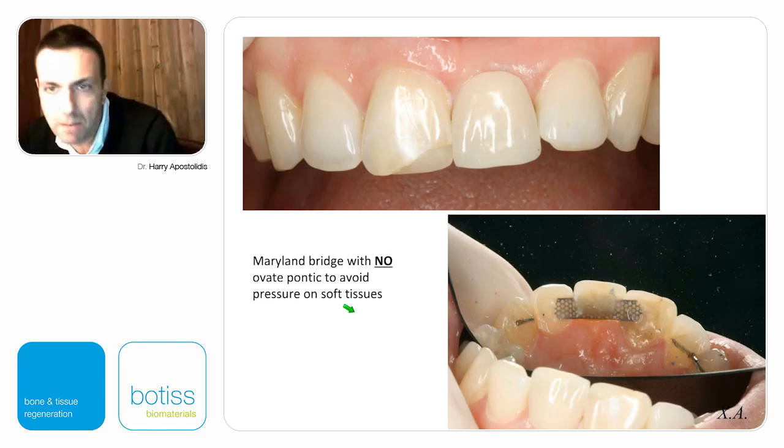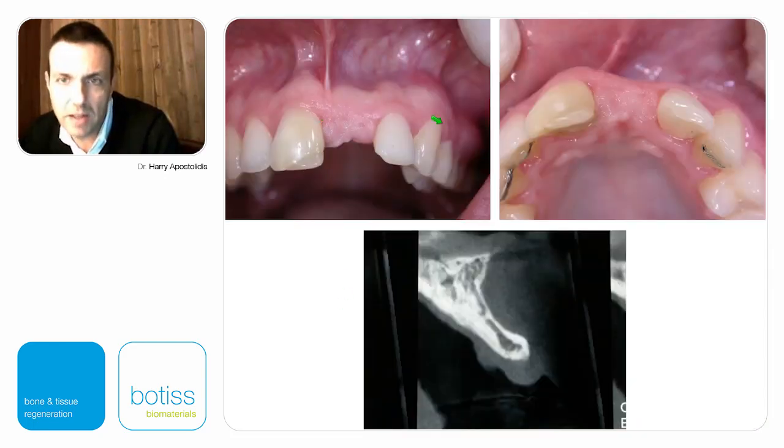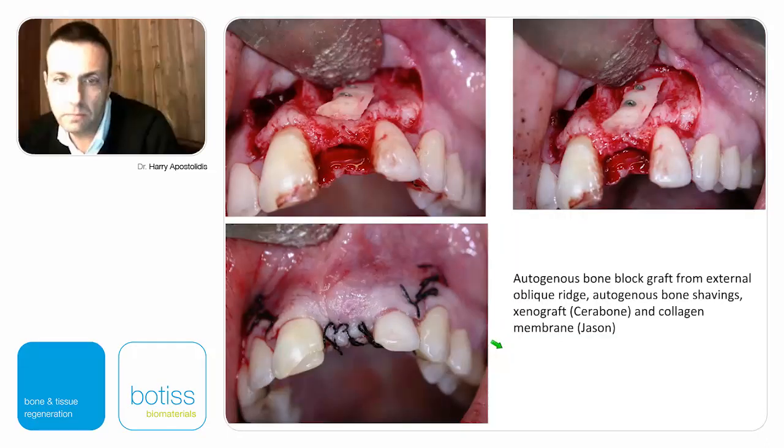After we place the implant, on implant uncovering, do whatever you want with pressure on the soft tissue to sculpt it. But before that, don't do it. We want this healthy tissue to work with. You see how thin the anterior maxilla is? Again, the same stuff. I don't have all the pictures. I have blocks. It's always the same. I'm telling you, a team that wins does not get changed.